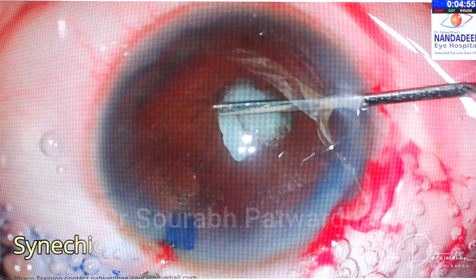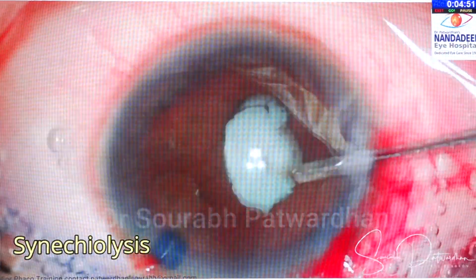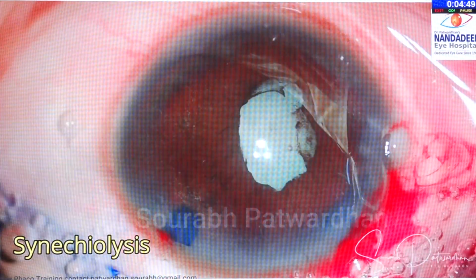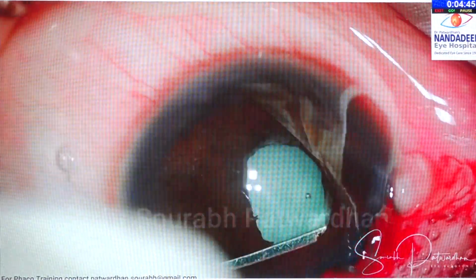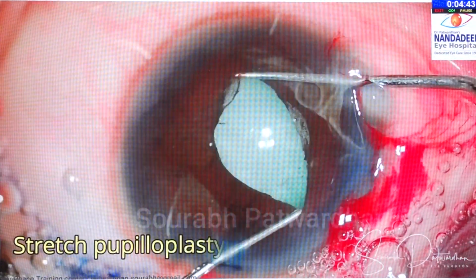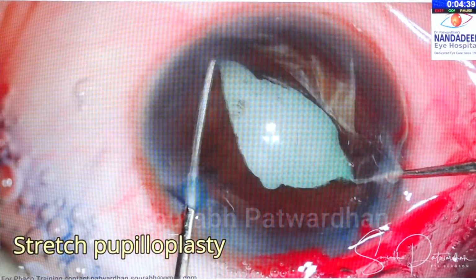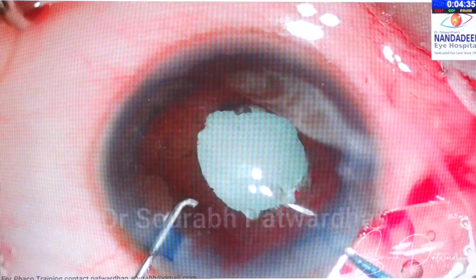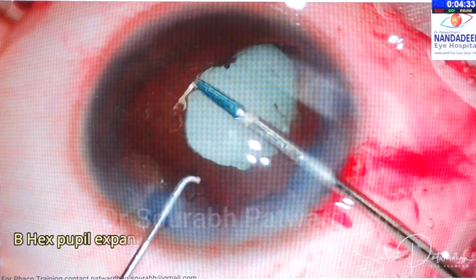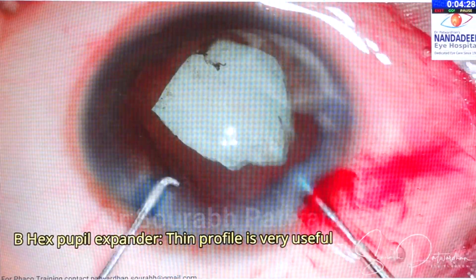Sometimes you may find a pupillary membrane which you can remove, but sometimes the pupillary membrane is not there. So you just have to separate the synechiae using any blunt instrument like an iris repositor, or you can use a blunt Sinskey hook as well. And then a little bit of stretch pupilloplasty before we put the B-Hex. Frankly, this B-Hex has worked for me in all these cases, particularly shallow AC, because it has such a thin profile that the anterior chamber is not lost.